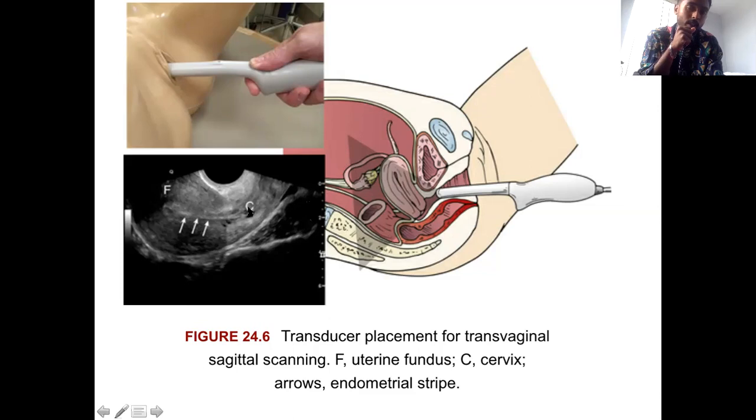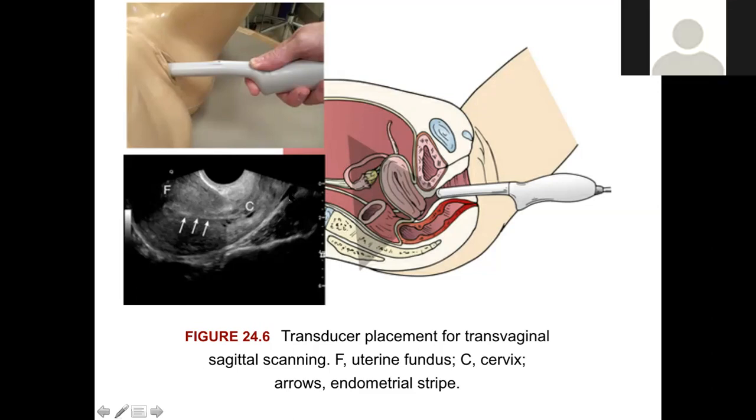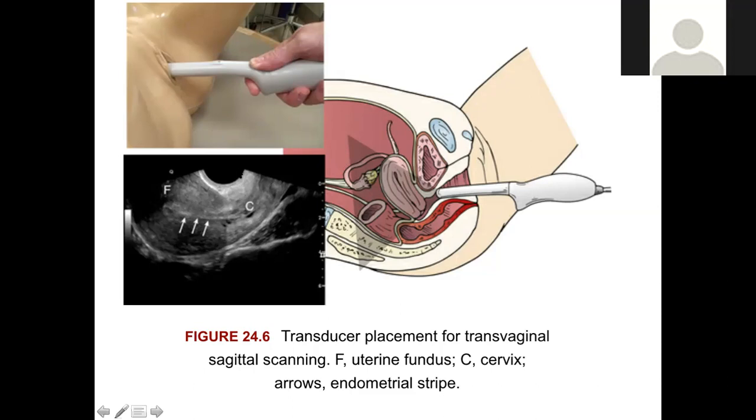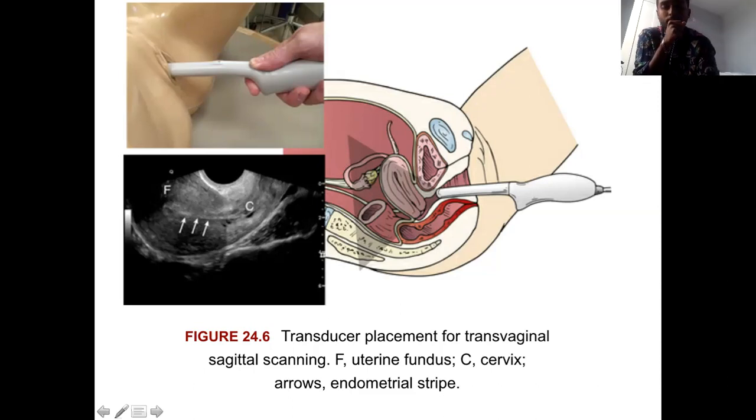The vagina would be, actually, that's where the transducer is. So remember, this is the rectum, this is the uterus and cervix, and the space between would be what? That's the retrouterine pouch. Yeah, it's very clinically important. And because it bends, it's like a mind trick. It really messes with your mind. But the vagina is actually up here, and then it kind of curves. It's because the transducer is here. But this is the rectouterine pouch.